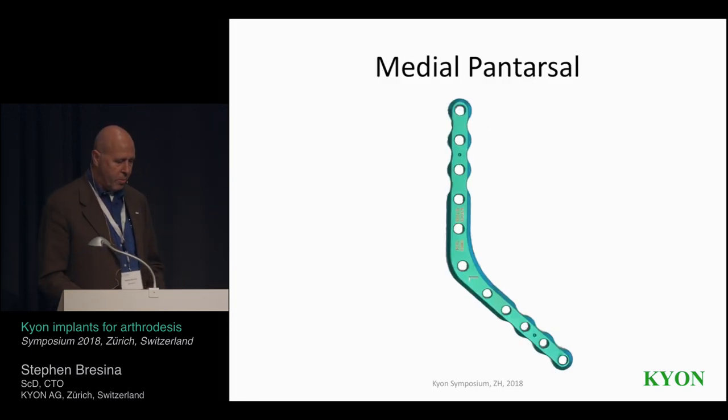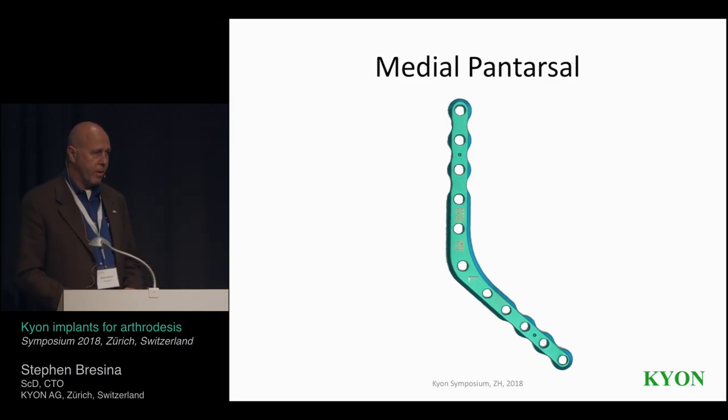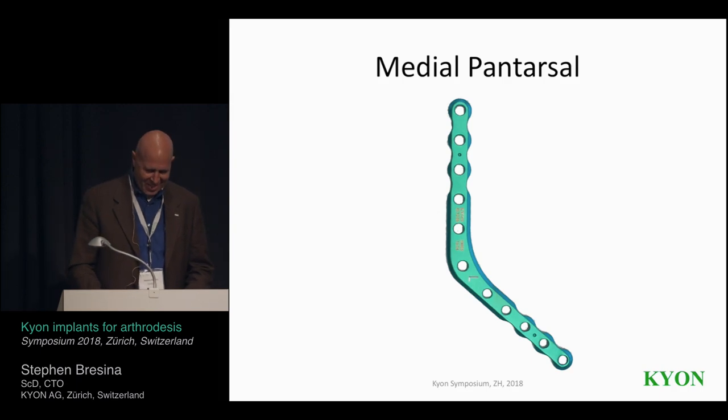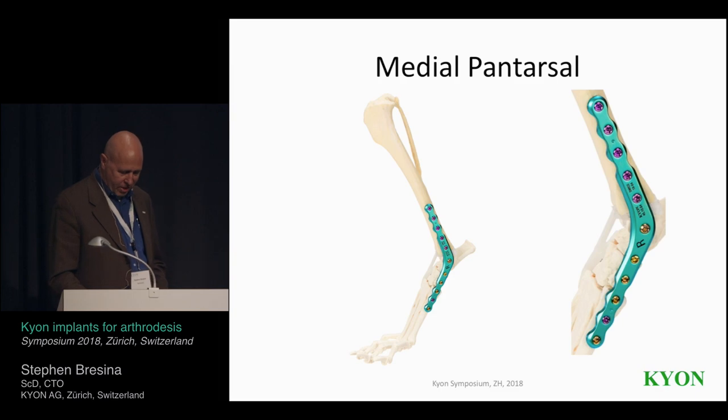So the first one is the medial pantarsal plate. Again, it looks like a boomerang, but we avoided calling it a boomerang plate because boomerangs come back to you. We don't want these coming back, so we avoided that in the name. This is the indication of how it looks when it's put on there.